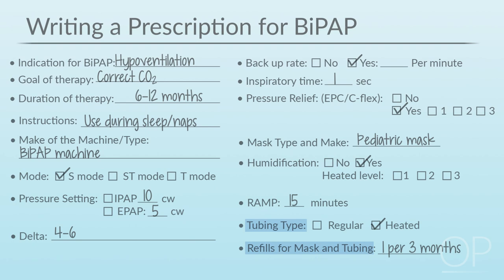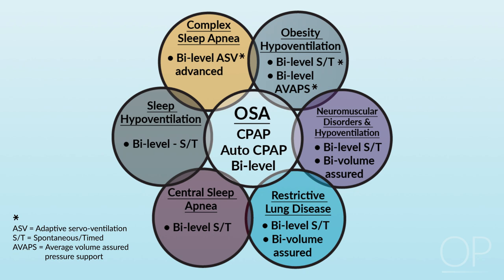So this is a cartoon which shows, based on the different modes of CPAP and BiPAP and underlying conditions, you can use this in various respiratory situations.